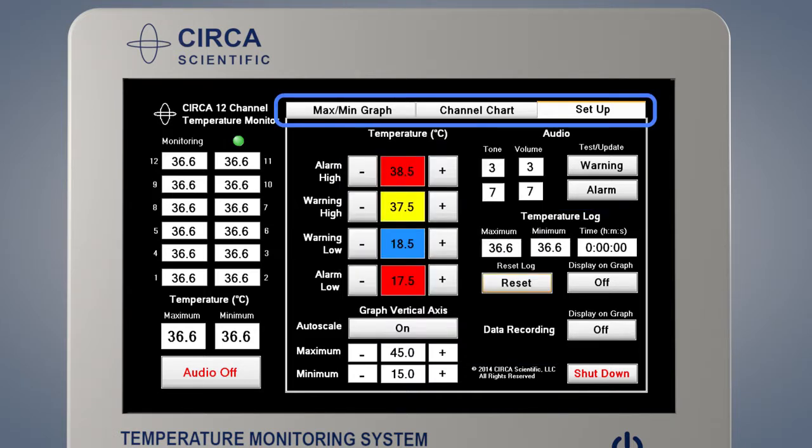The Circa monitor has three different screens which may be navigated by touching the tabs at the top of the screen. It has two different screens to display the temperature monitoring data: the max-min graph screen and the channel chart screen.